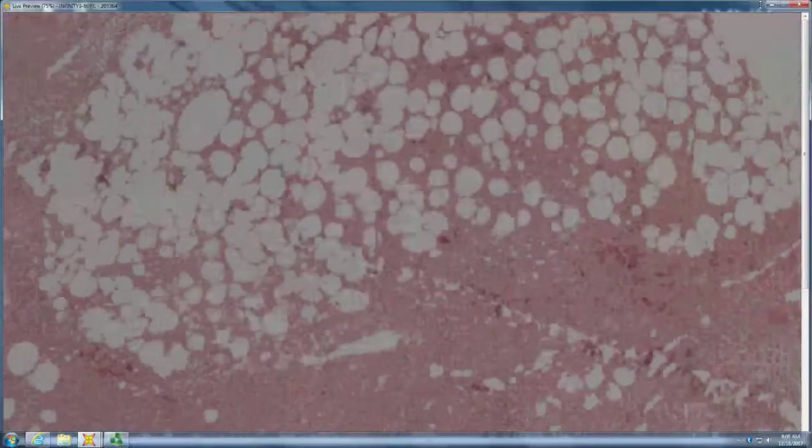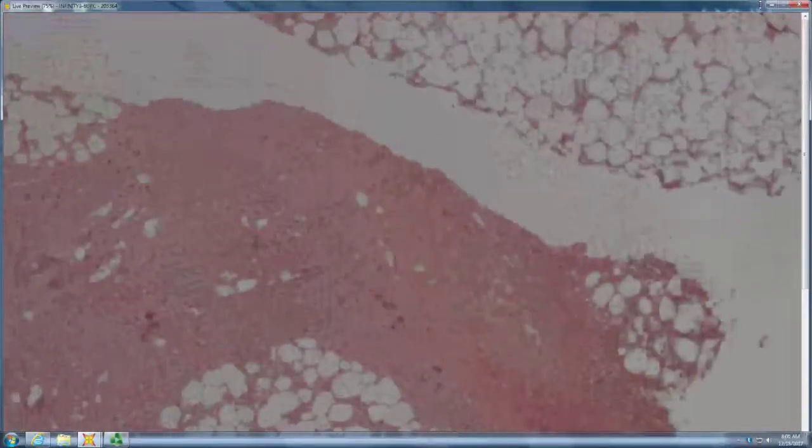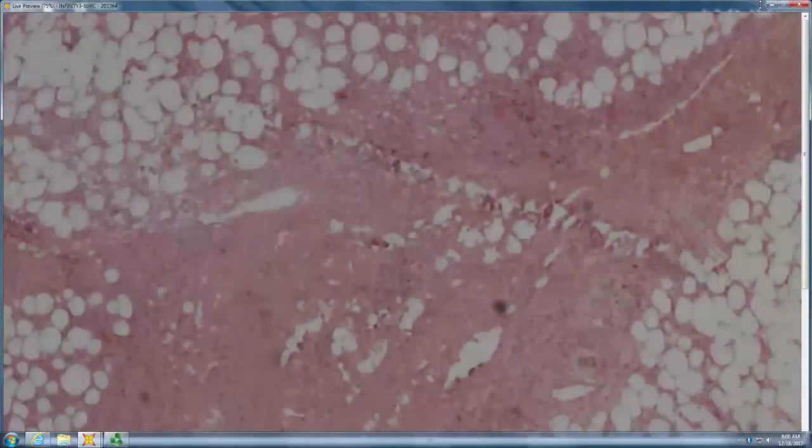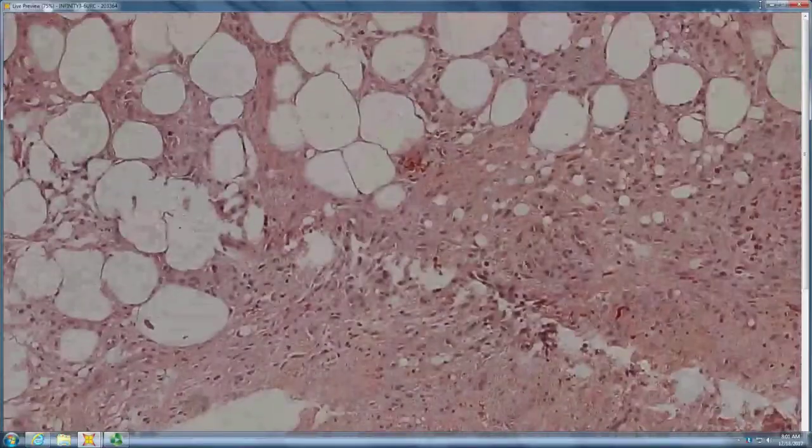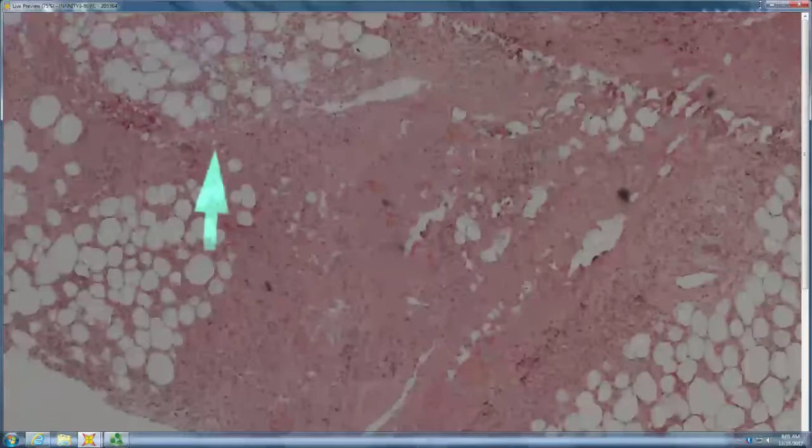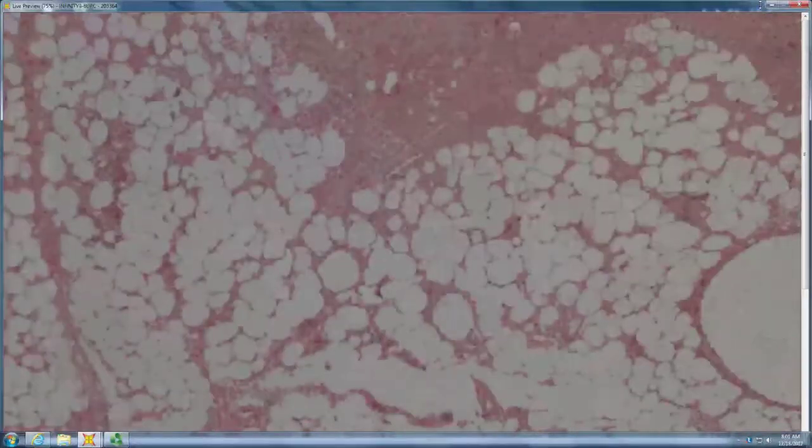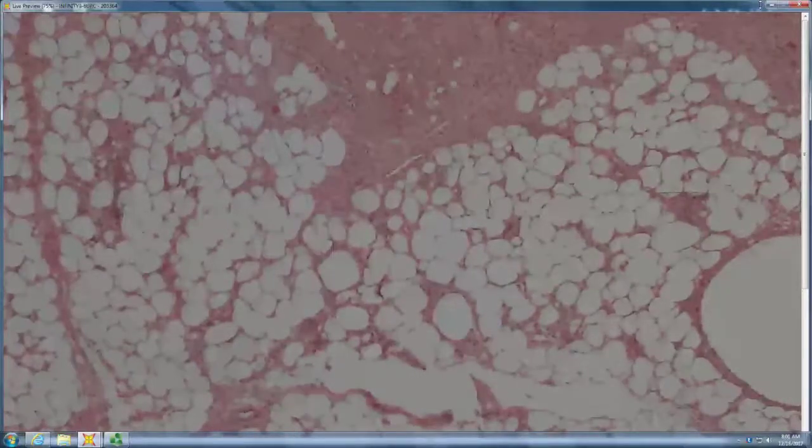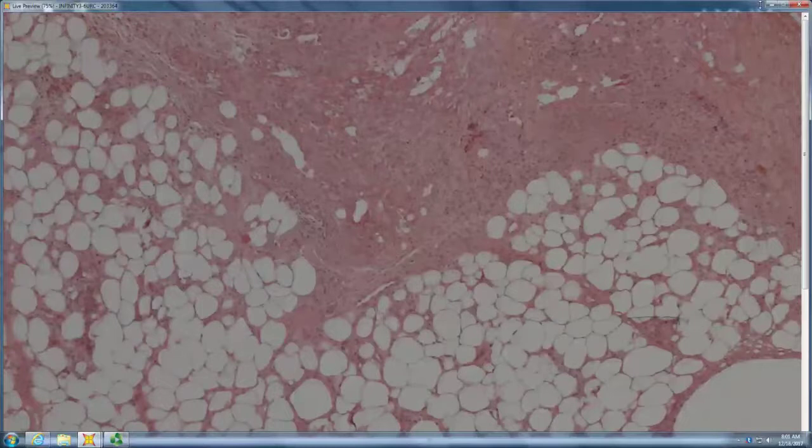It looks like predominantly lobular. Maybe some lipomembranous change maybe in the center. Let's just look to see if there's lipomembranous there. So a little bit of lipomembranous change here. That septum is pretty wide. Clinically it was erythema nodosum. There is a little bit of lobular necrosis here. So what do you do when it looks like erythema nodosum, but there's some lobular necrosis. You look for things on both sides. You look for all causes of septal as well as causes of lobular panniculitis.